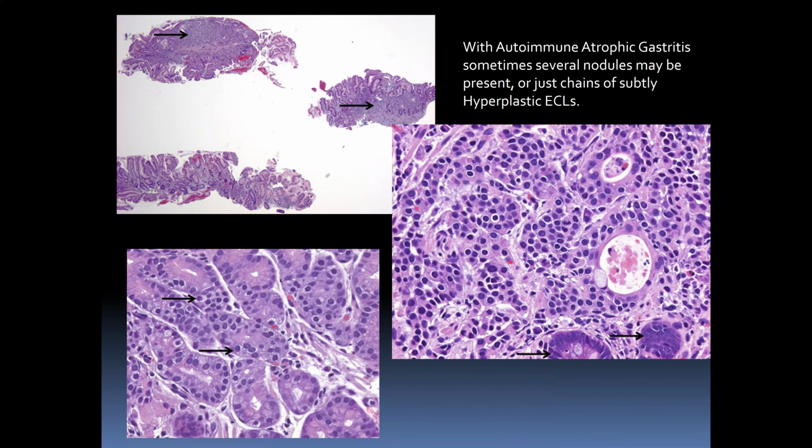So here's an example from autoimmune gastritis where in addition to finding occasional tumors like this one here, or maybe a little bit one over here, what you may more preferentially see is just areas of enterochromaffin-like cells that are sort of streaming or continuous and hyperplastic in association with residual gastric epithelium. And down here you see the intestinal metaplastic feature of this disorder.